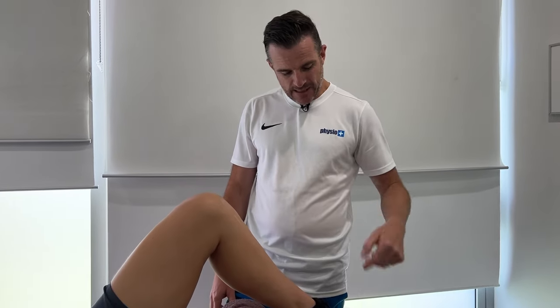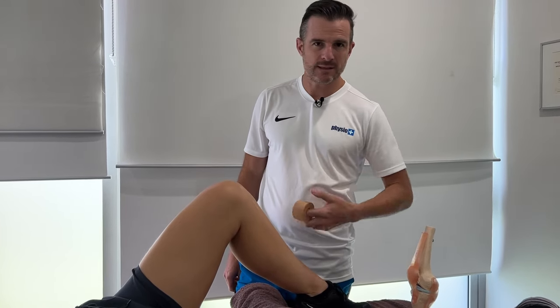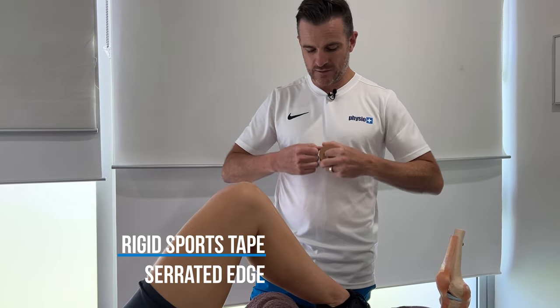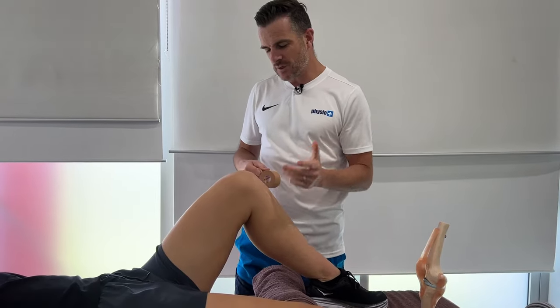Whether you are acutely injured or returning to sport, this taping works the same. Normally, if you're having this tape on for a long period of time like three days, we'd use an underwrap. For sports where it's on for three hours and going to come off, just use rigid tape. This is a rigid sports tape — it does not flex in any direction, and it has a serrated edge allowing you to rip it without tape scissors.